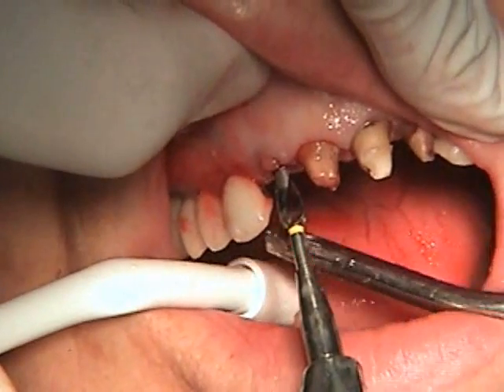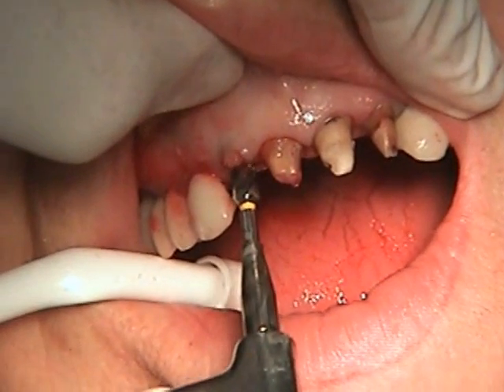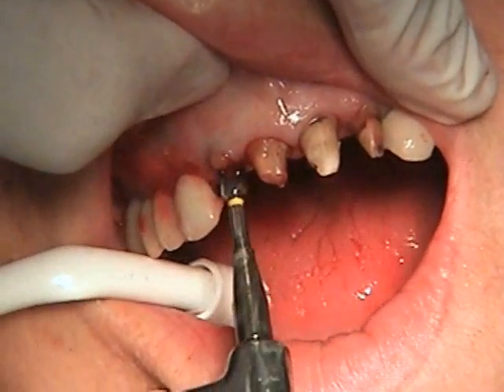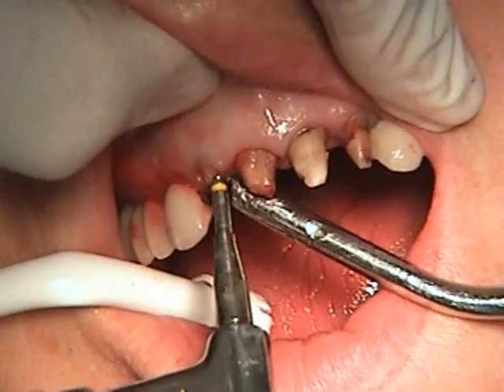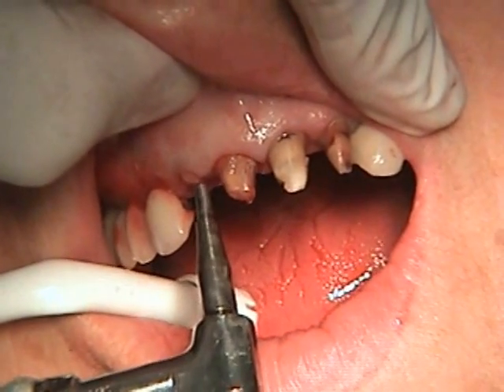We'll remove the 3.5 pilot. Then I'm going to use the 4.3 final drill for the Blue Sky Bio Trilobe Compatible Implant, which is prosthetically compatible with Nobel Bio Care Replace. I'm using it very slow because the bone is quite soft.